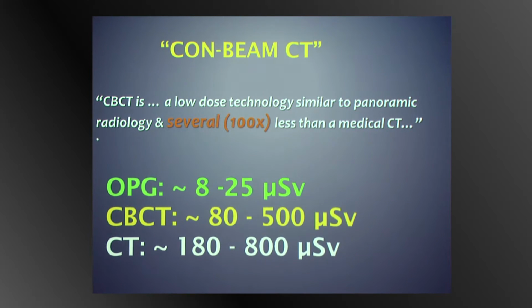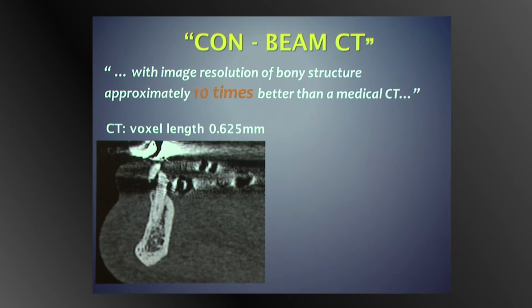As I said, most of the literature pertaining to cone beam over the last 15 years has been in the dental literature. Most of it's very poorly written. It's been indirectly or directly financed by the companies that make the machines. And it perpetuates the same rubbish in numerous statements, such that one of the surgeons who doesn't like it gave it the nickname of con beam. The doses we've seen, they vary tremendously according to who you read, but a lot of the cone beam literature will refer to doses from CT dating back to the mid-90s or even earlier. So it does have higher resolution.